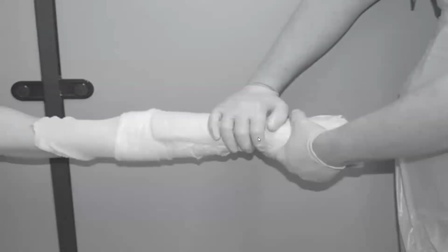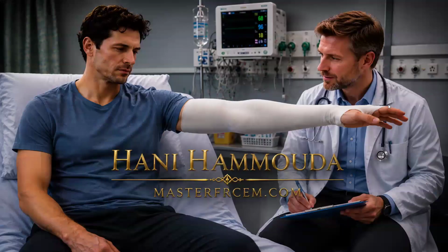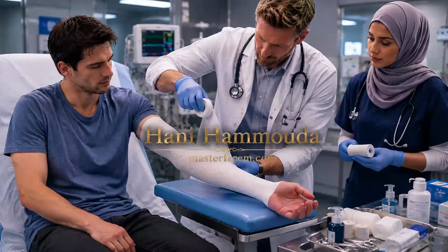You put the stockinette, for example, 10 centimeter below the metacarpophalangeal joint. Don't worry, clear? But in verbalization, you should be accurate when you say 10 centimeter here, 5 centimeter here. But in application, if you are not accurate, don't worry. Here also, if you are not accurate in application of cotton padding, don't worry.